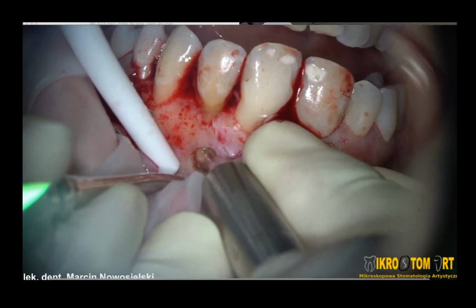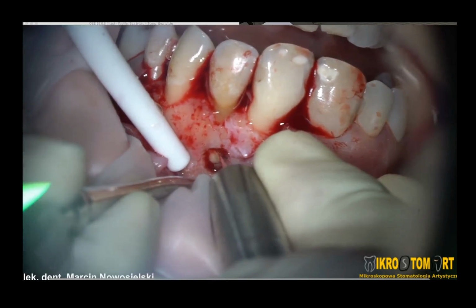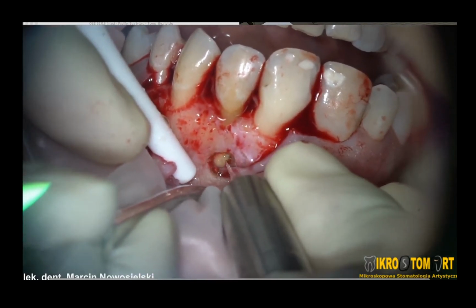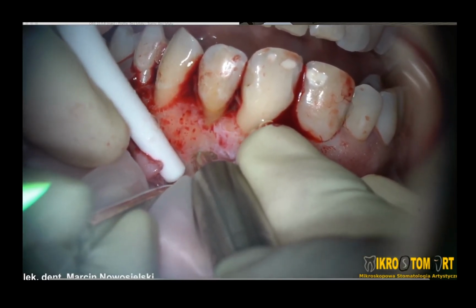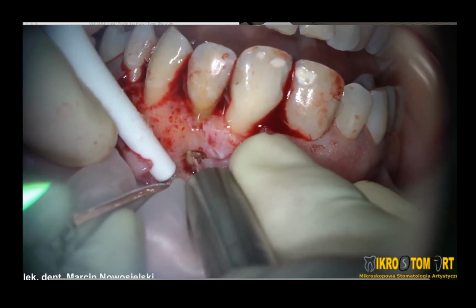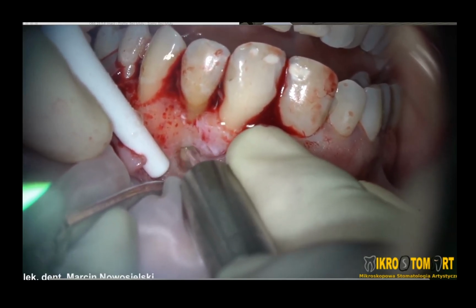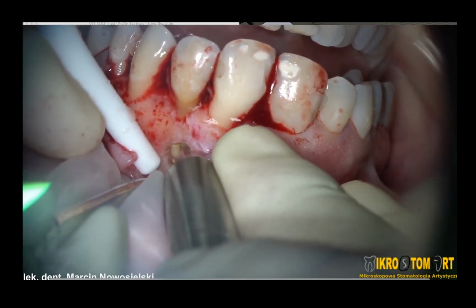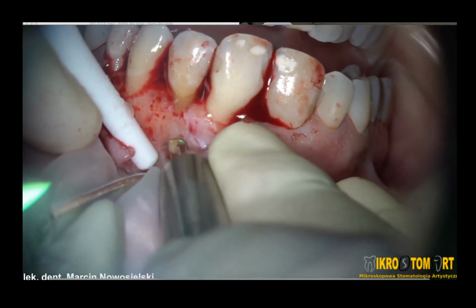And actually, even if I didn't want to record it, it would be easier to do it with the straight handpiece. But the whole process was going much slower because I was recording while working, so I wanted all this to be visible. So I was always taking care and looking at the screen to see if everything is visible.